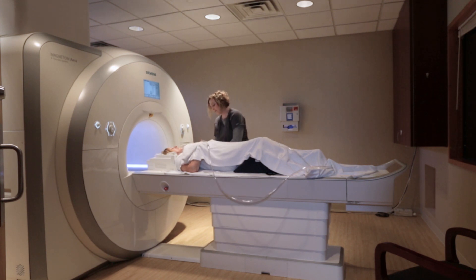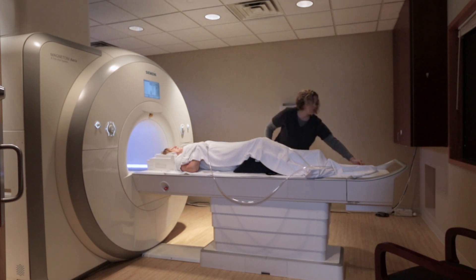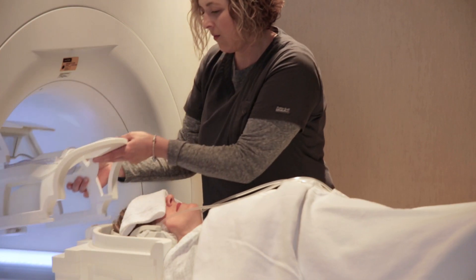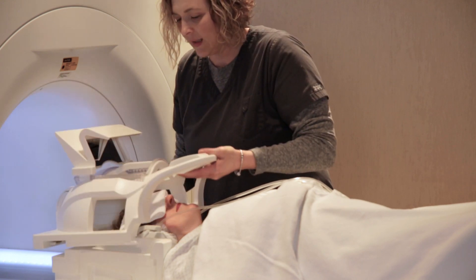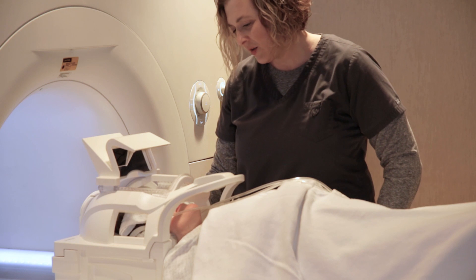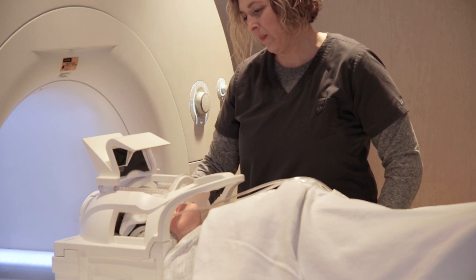We also like to give you a security squeeze ball. If for some reason at any time a patient is not comfortable, all they have to do is squeeze that ball and we come right in and bring them out. We don't like to leave the room unless we know the patient is very comfortable. Then we'll go ahead and position the head coil over the patient, and then we'll send them into the scanner if they're ready.